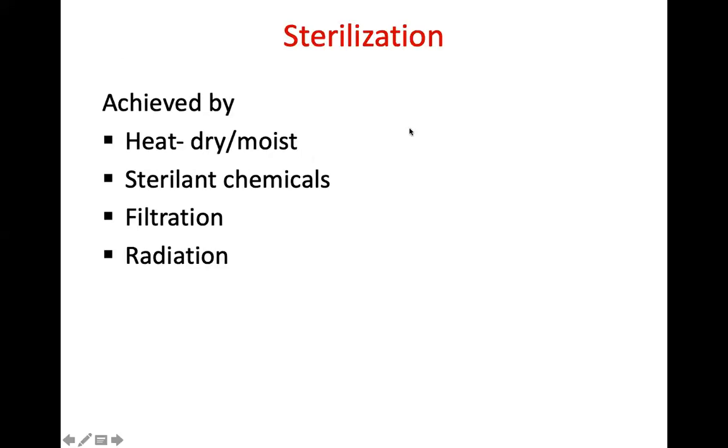There are different processes that can be used for sterilization. I want us to just look at some examples of sterilization processes and disinfection processes, and then we go into infection control, okay? How we can carry out infection control in a hospital setup. So sterilization, there are different methods of sterilization, and the choice of the method you'll use depends on the volume of items that you want to sterilize, the compatibility of those items and the method that you're picking.